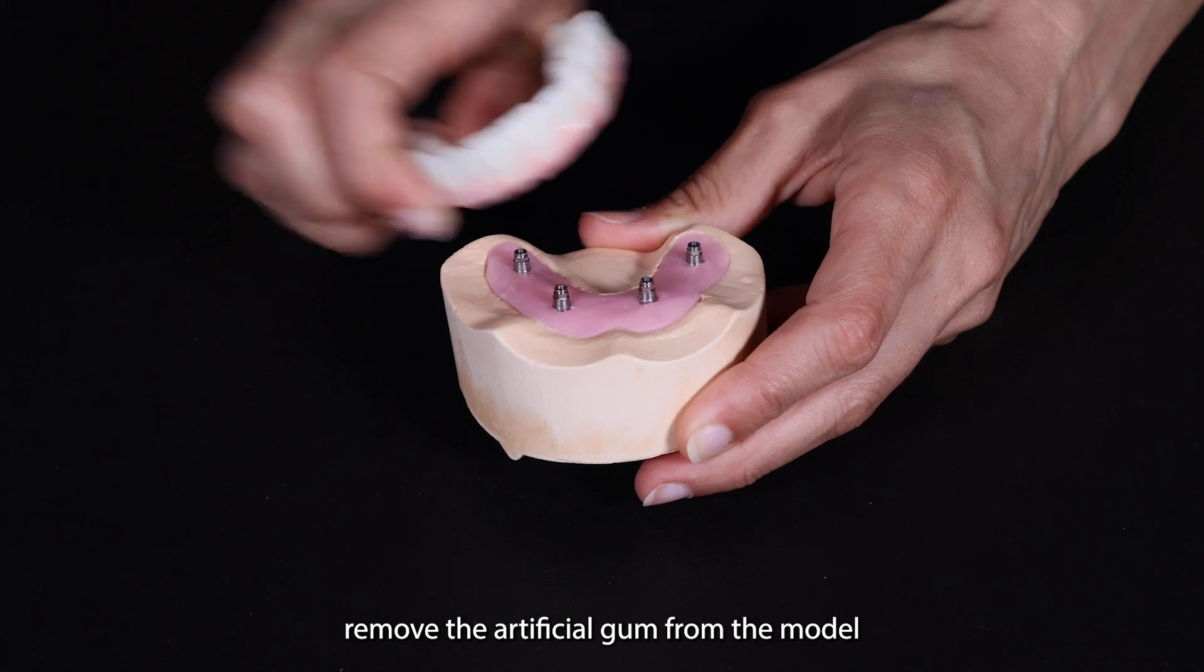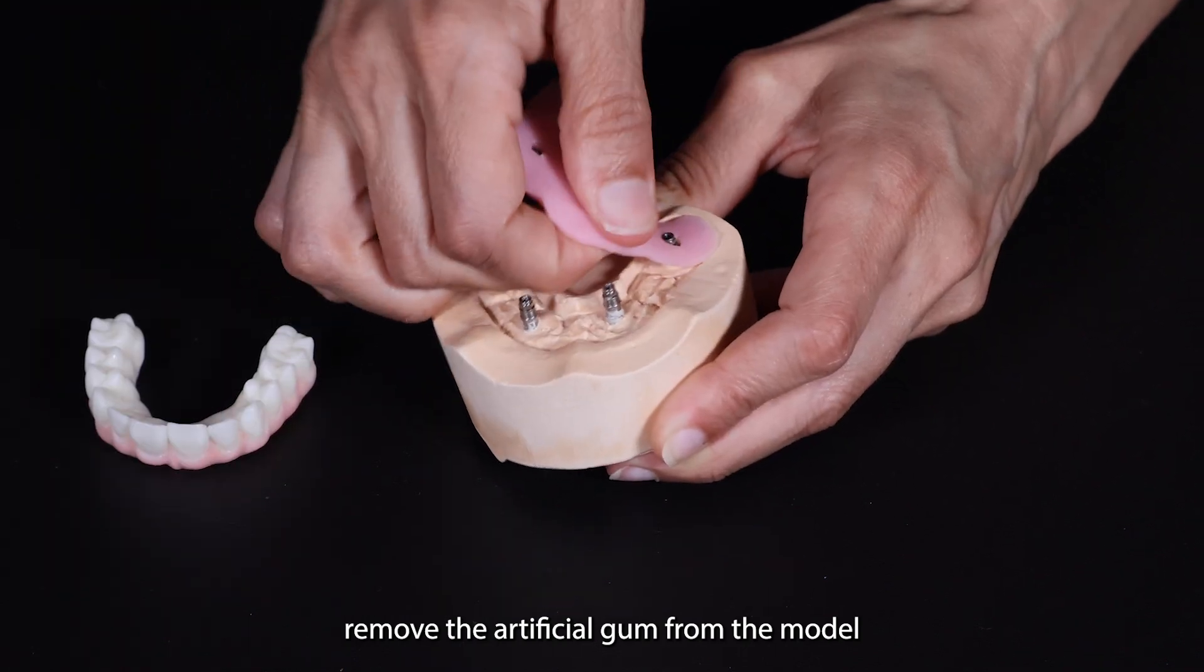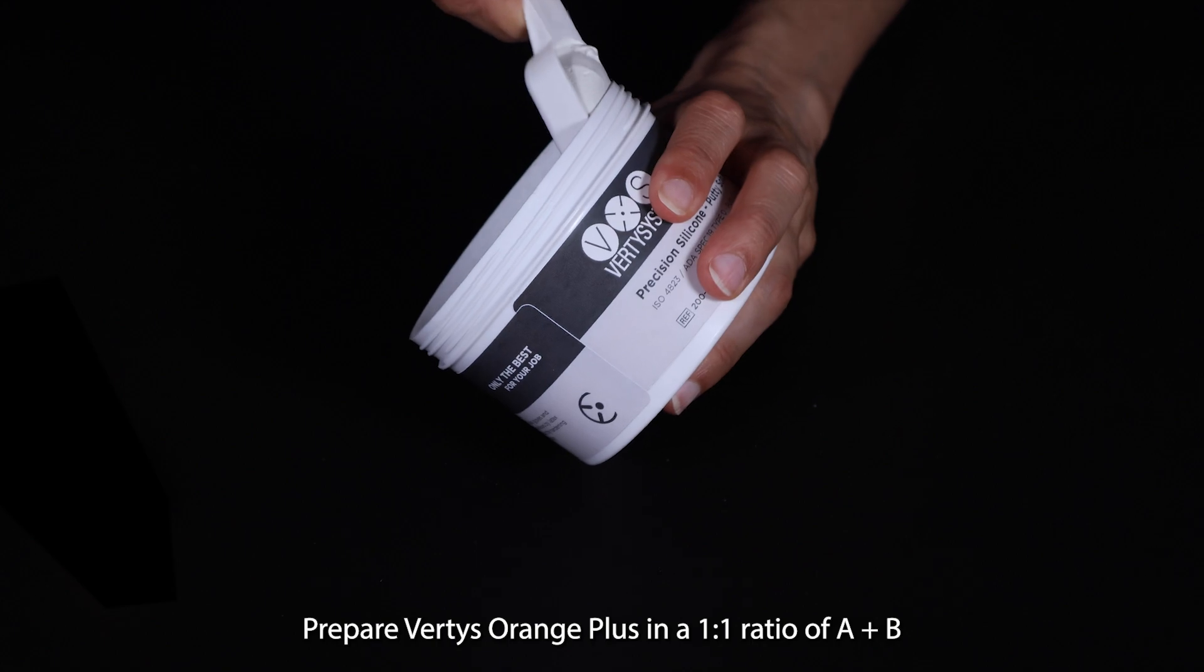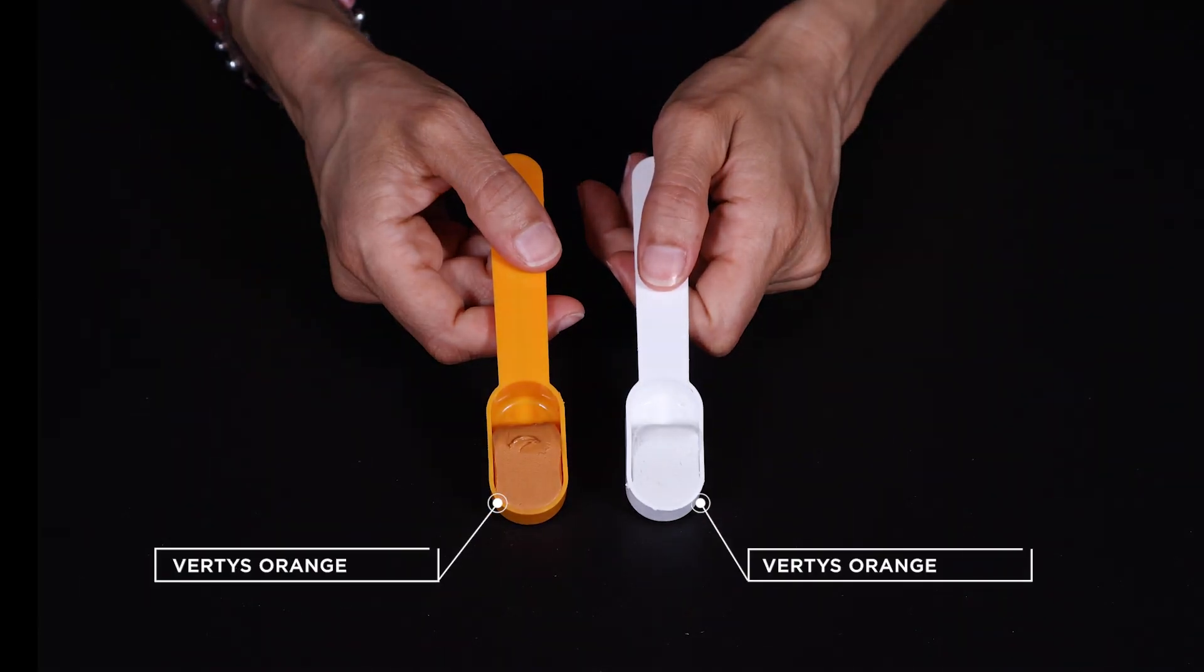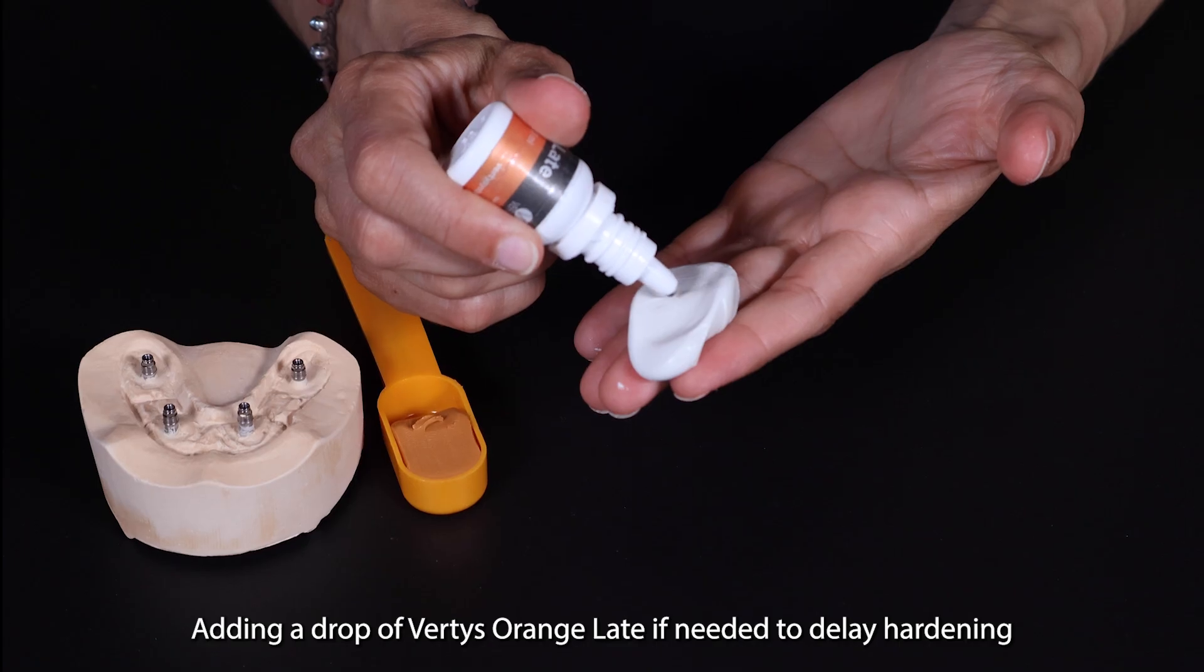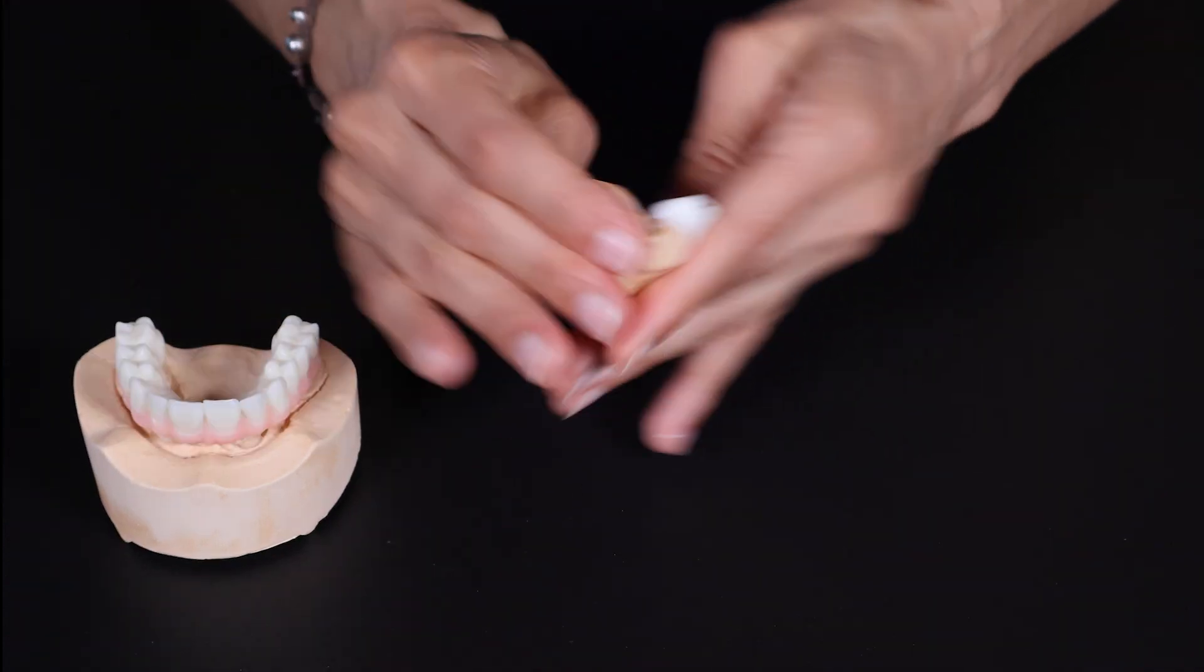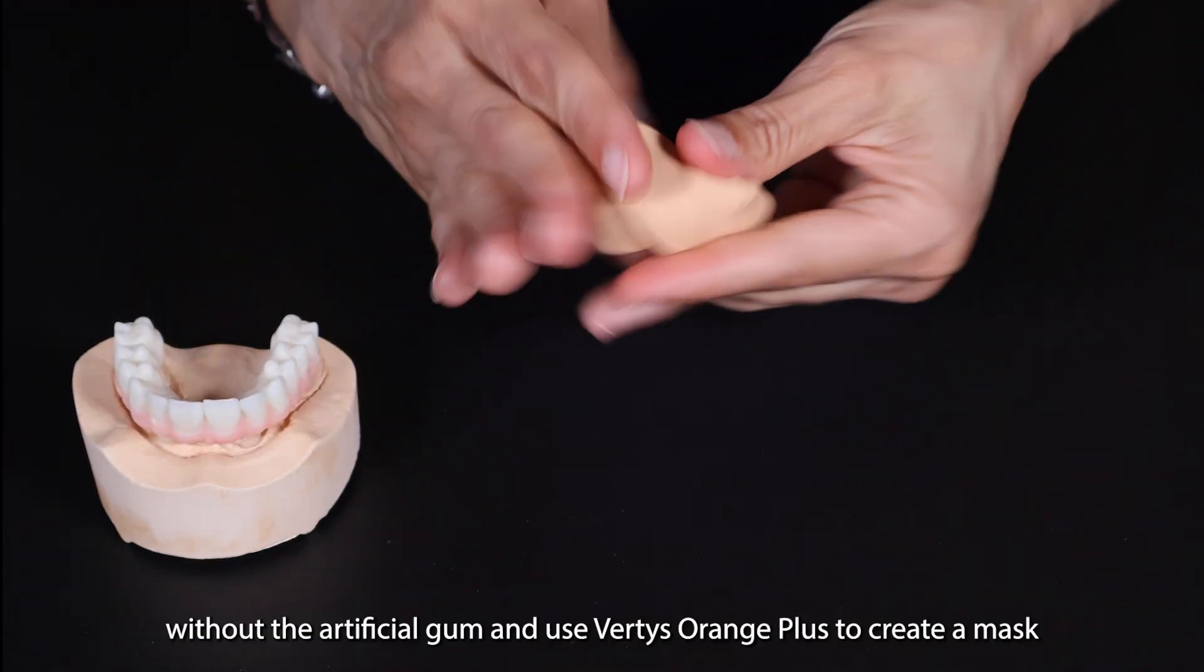To begin, remove the artificial gum from the model. Prepare Vertis Orange Plus in a 1:1 ratio of A plus B, adding a drop of Vertis Orange Late if needed to delay hardening. Take the 3D printed project without the artificial gum.